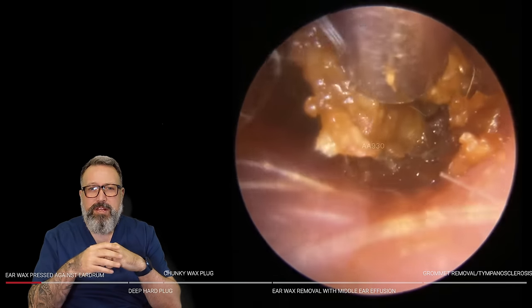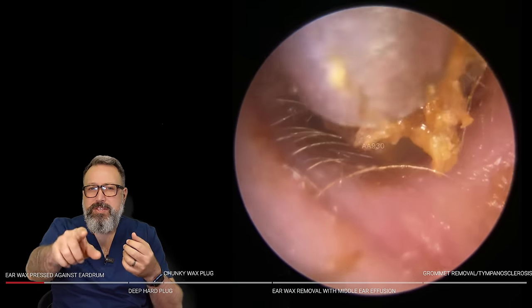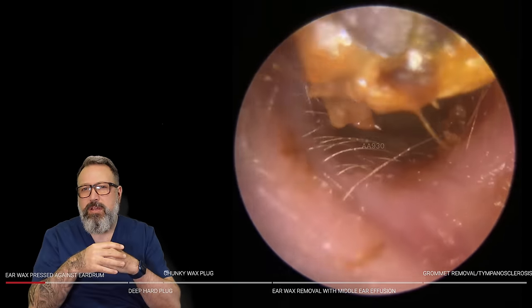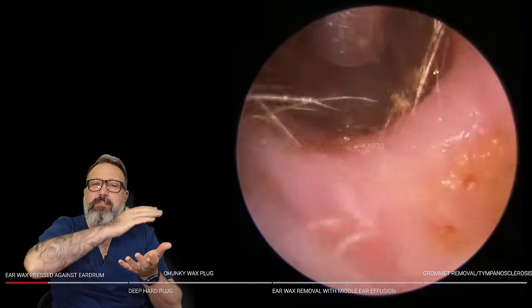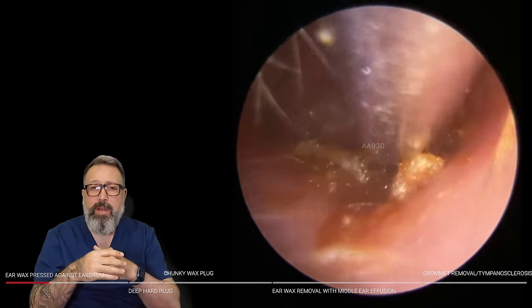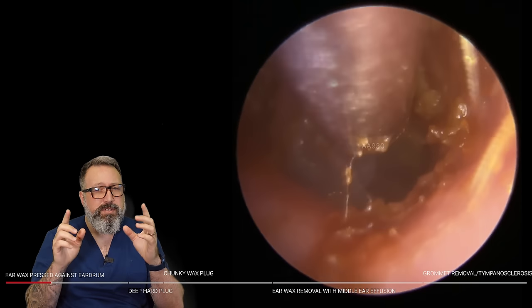There's a little bit of dry skin, a little bit of keratin coming up off the bottom of the ear canal wall, and you can see it's interspersed into this plug. We're just giving this a bit of a pull — it has that layer of keratin. There's almost like a keratin ribbon running all the way through the wax.